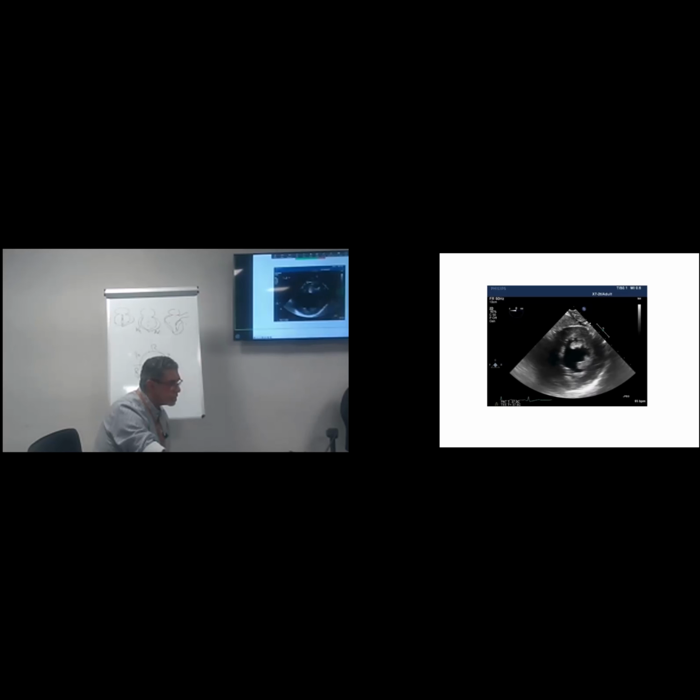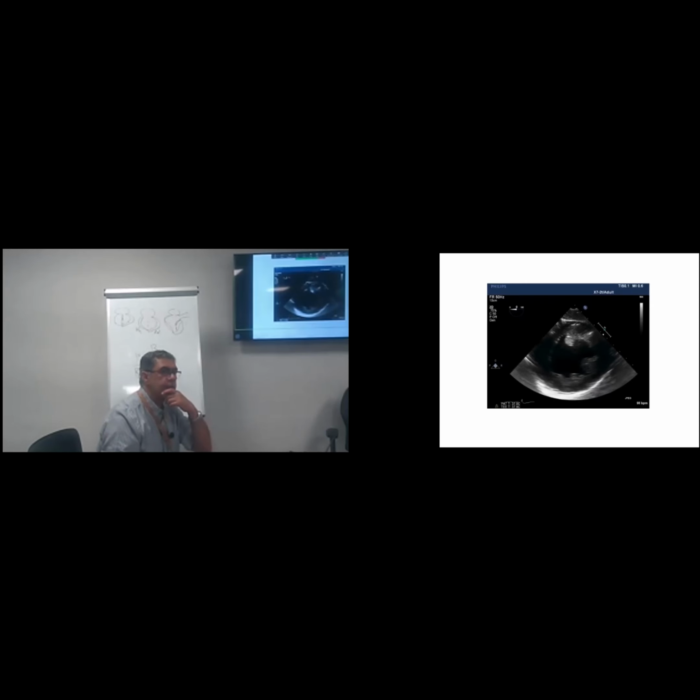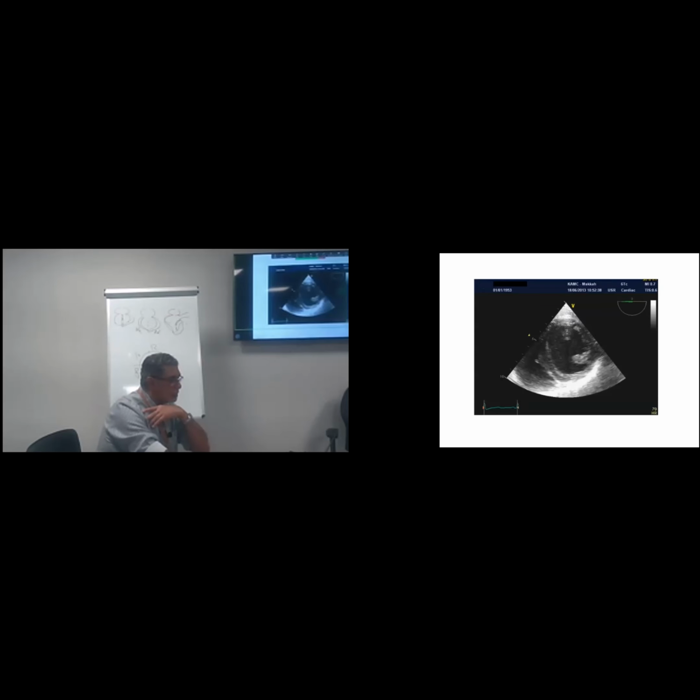Like this? Yes. Here. Like global. Excellent.